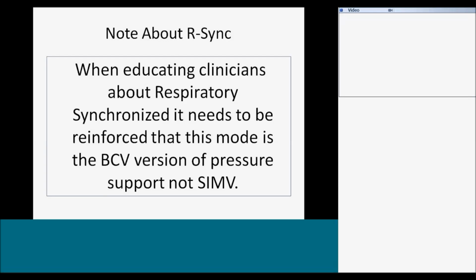Every inspiratory effort should and generally does result in an inspiratory phase on the Hayek. At the end of inspiration, it switches into exhalation. With SIMV, it gives the number of breaths per minute set on the machine synchronized with patient effort, but not every single breath receives full support. So it is more like the pressure support version, if that question ever arises.